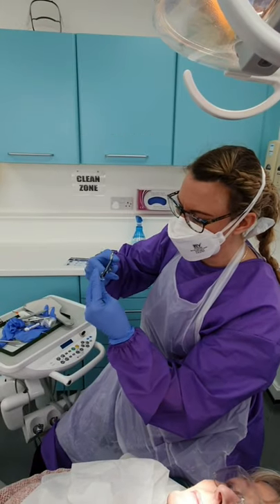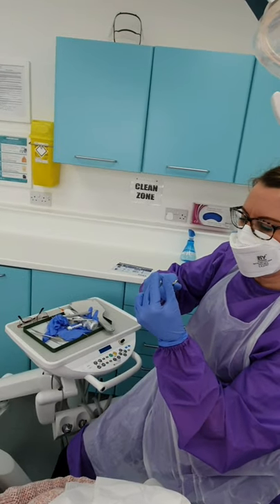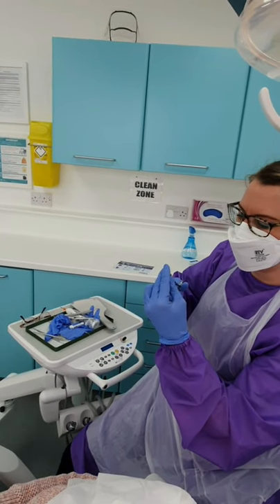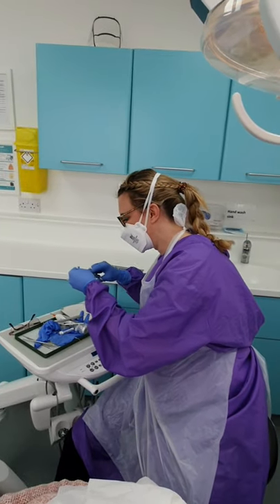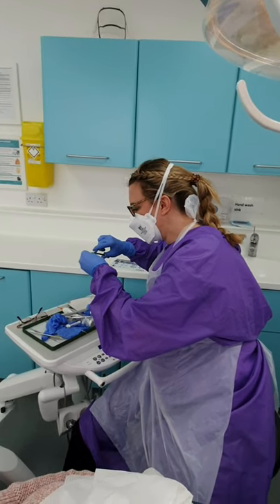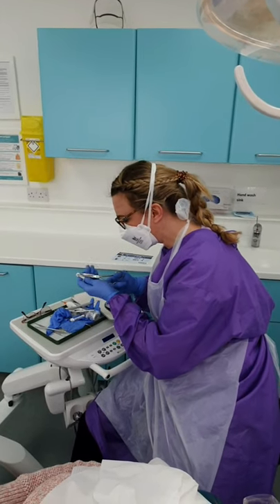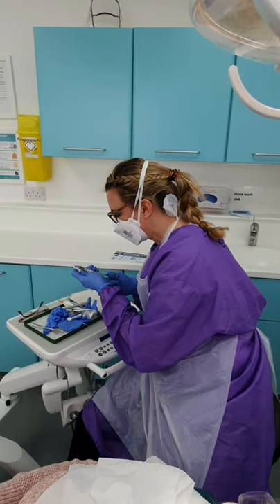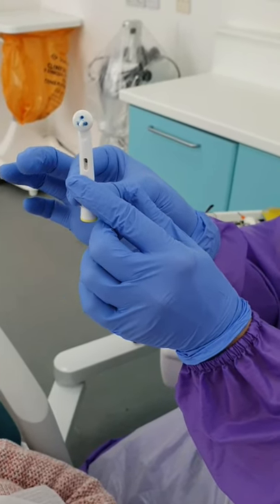I've got my mask on as well. Obviously we're in surgery, so we've got a patient in the chair and I unfortunately can't take my mask off. You're just going to have to try and put it on maybe a higher volume so you can hear what I'm talking about. These are not the best scissors, but I'm doing my best — it's like giving it a haircut basically. This is roughly chopping off the blue bits and you're left with this centre white part.